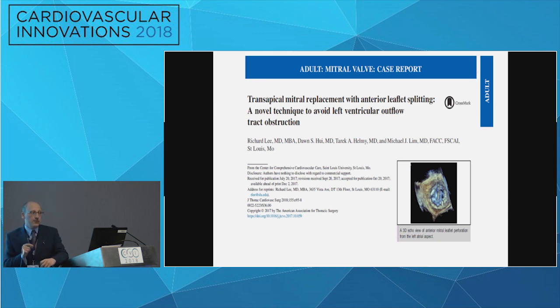We believe that if you do this under rapid pacing, which you would usually do, you would not have a risk of significant migration atrially of the subvalvular apparatus. I think we would position it right at the annulus and anchor the Sapien at the annulus without significant pull. And whether you like the laceration or the translocation like the surgeons do, I've talked to surgeons who say, with this translocation, we just slice it down. And some people said, you balloon it and you actually produce a laceration that is uncontrolled.